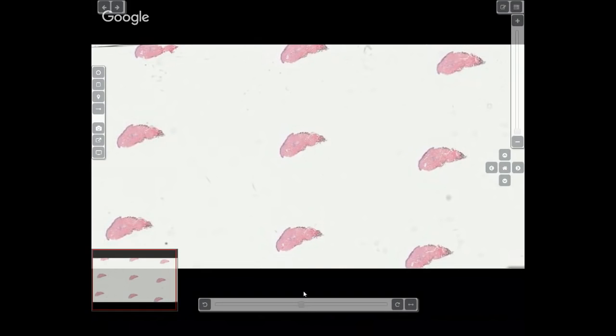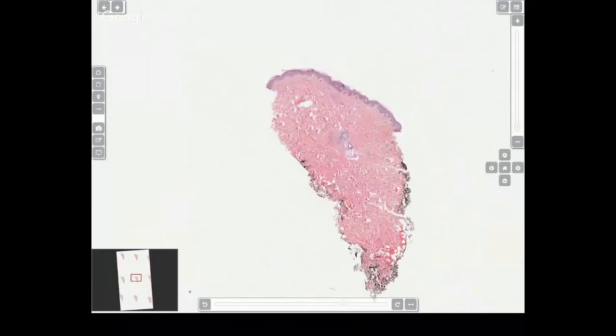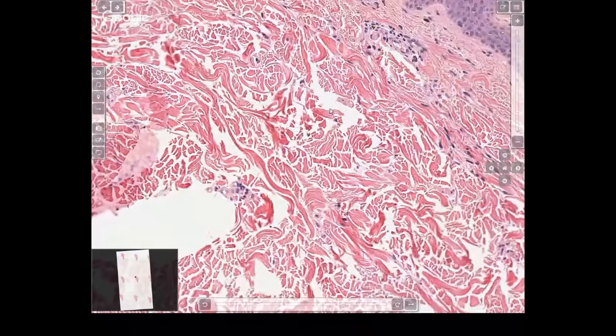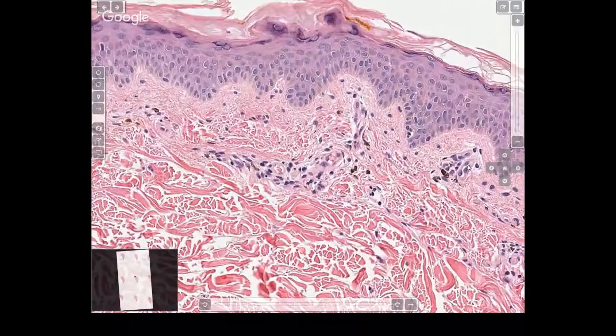Histology is very subtle, you don't see much. All you're going to see is a very mild lichenoid infiltrate at the dermal epidermal junction, but the characteristic feature is this pigment incontinence that you see here. So very mild lichenoid infiltrate, but very characteristically you see all this pigment that is scattered. You have melanin pigment that is scattered in the dermis. So if you see pigment incontinence in the dermis with some lichenoid infiltrate, like I said, your main differential diagnosis is PIPA, ashy dermatosis, or lichen amyloidosis. This is an example of post-inflammatory pigment alteration.